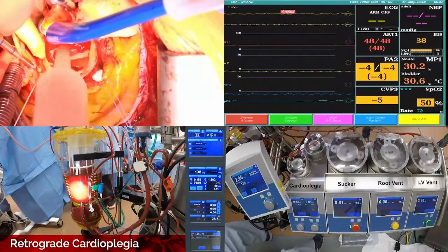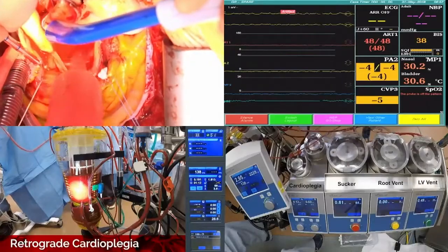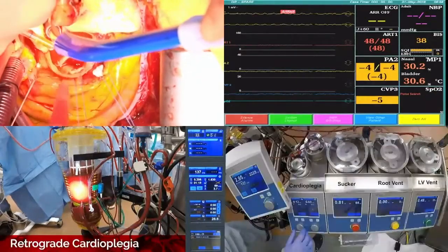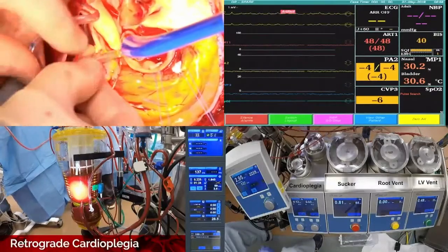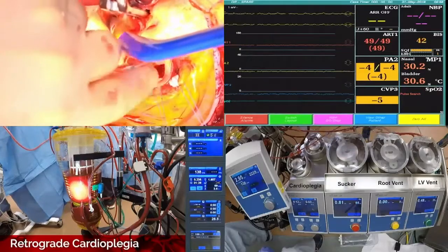So if you look at this valve, see how asymmetric it is from a surgeon's standpoint. The right coronary cusp is almost 50% of the circumference, because it almost goes straight across, right? And then the left and the non-coronary are like a quarter apiece, a little bit more probably. So that's why, in addition to their aneurysm, it failed.